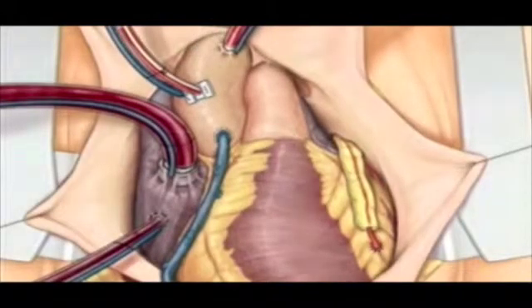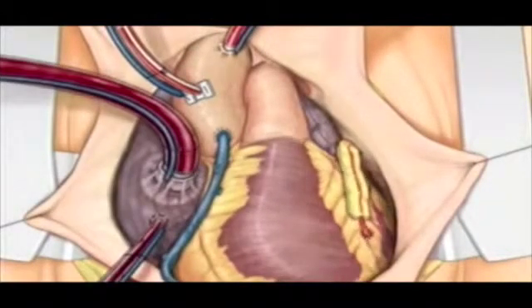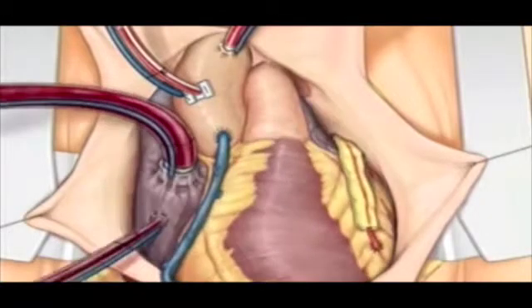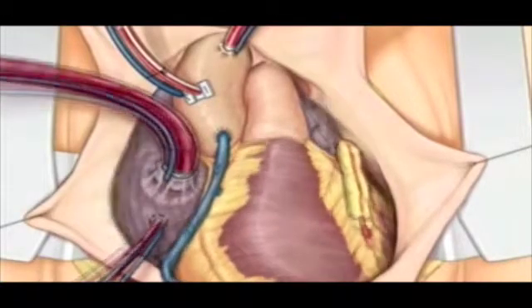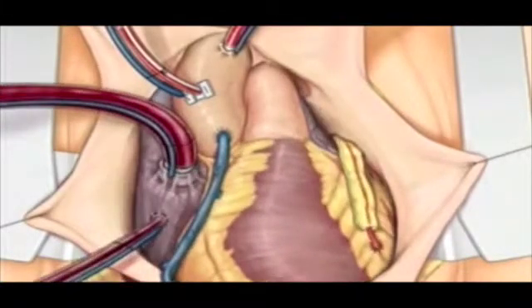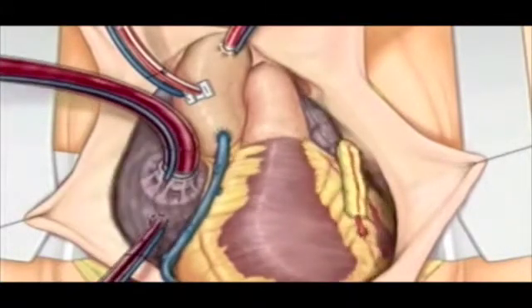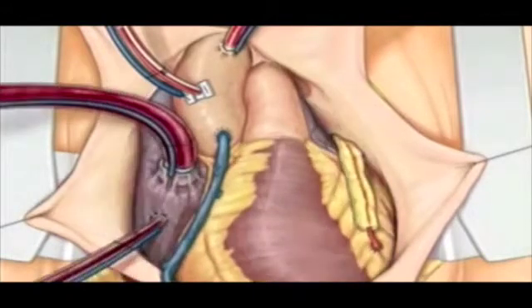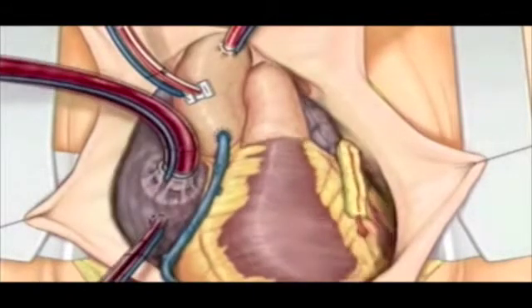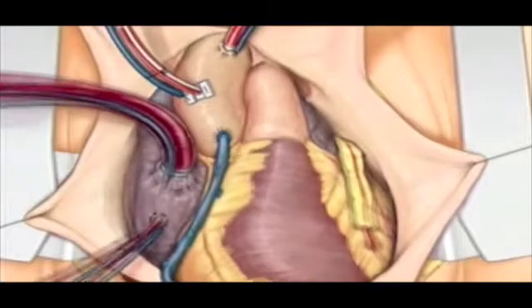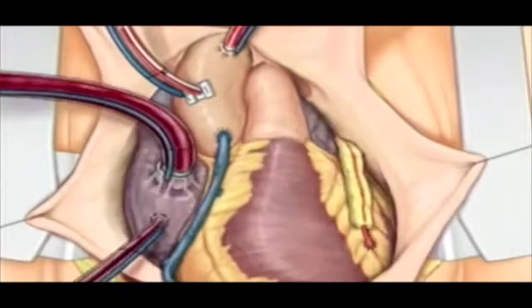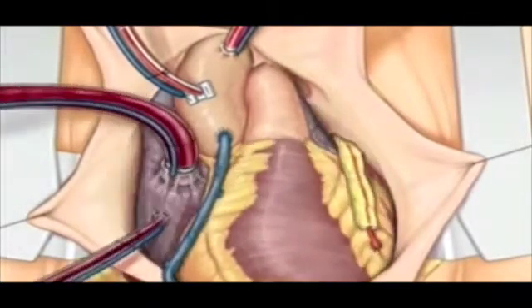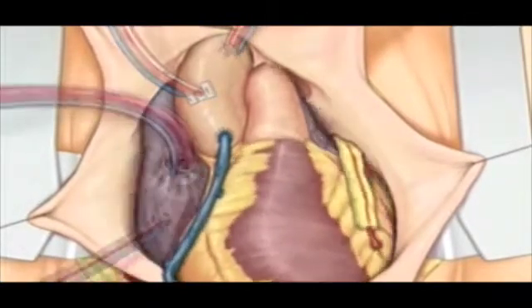We are now ready to come off bypass. As the flows are decreased and the heart is allowed to fill, following the Frank-Starling mechanism and allowing the cross-linking of actin and myosin to occur allows the contractile mechanism of the heart to be regained. Protamine is given to reverse the effects of heparin.